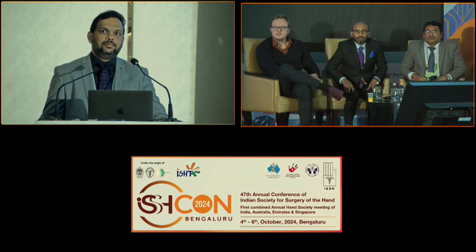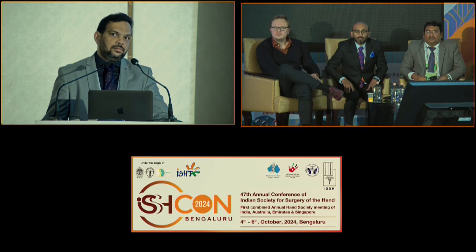Is it okay to make that central tear complete? You have a small tear with a small flap of tissue there, and now you are making a huge hole there for the wafer procedure. Is that okay biomechanically? We don't know whether the tear is the cause of pain or the impaction is the cause of pain, and this procedure is addressing both of them. So I don't think it causes any significant alteration in the mechanics of the ulnar side of the wrist.